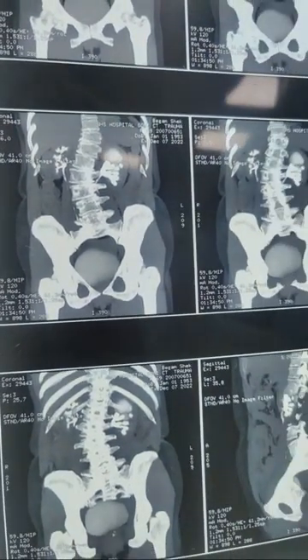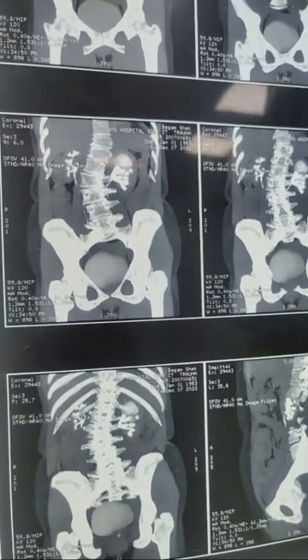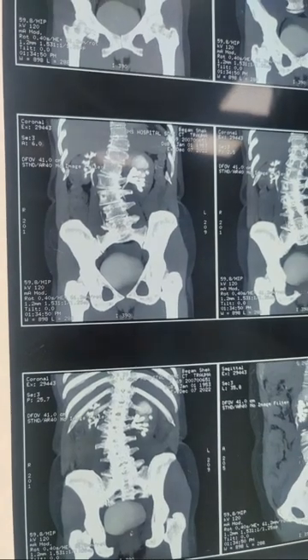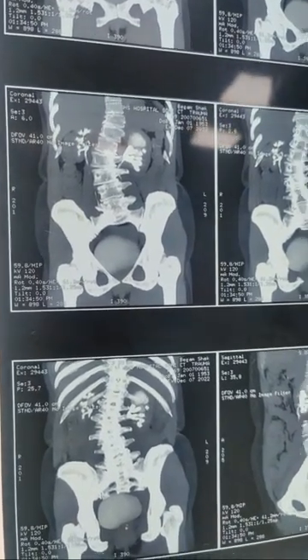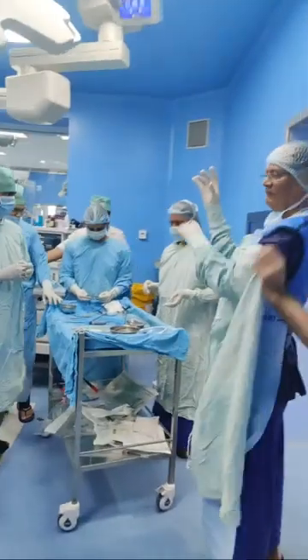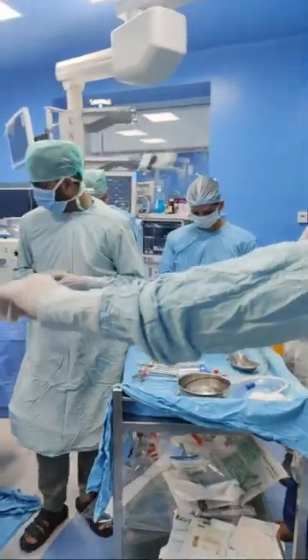So we are planning to go either to this upper calyx or maybe the middle calyx, which we will decide on the table only. So this is the case. And here now Dr. Kaushik will tell you about the instruments.